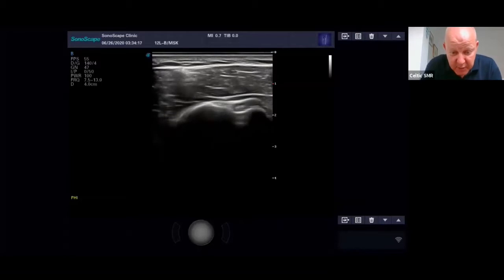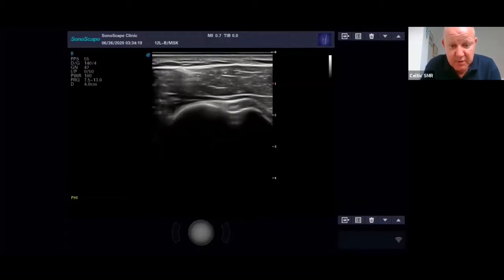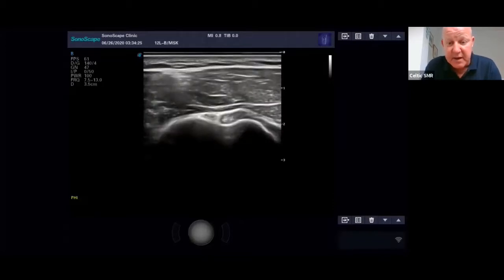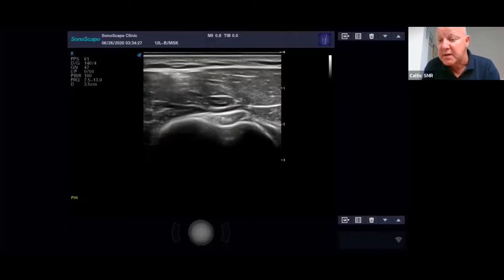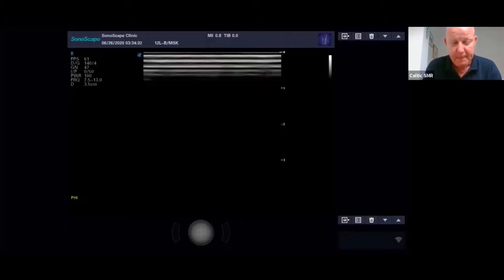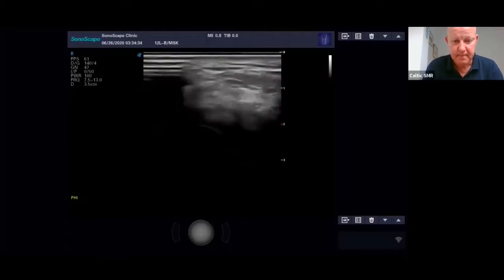But just had a question come in. Can you demonstrate a dynamic assessment, for example, a patient abducting the arm? So if you've got someone with a thickened bursa, which actually I did have, didn't he?